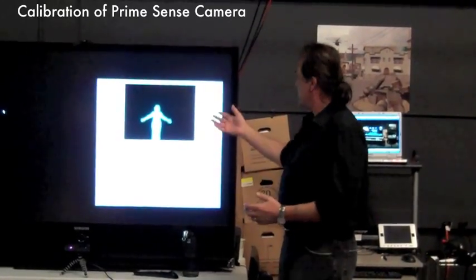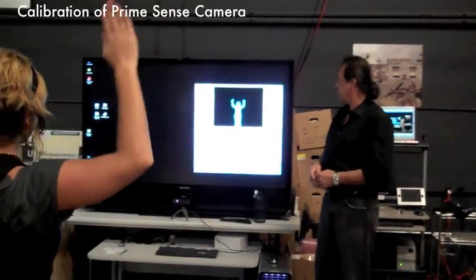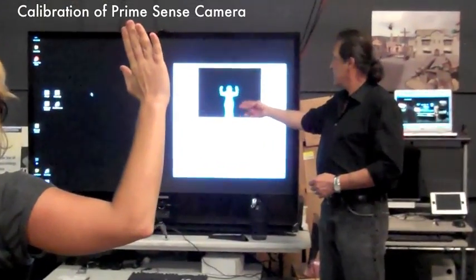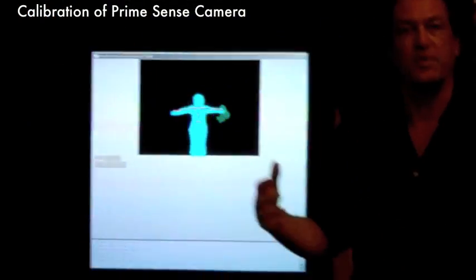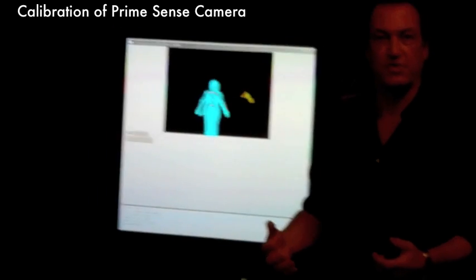You'll notice our user here is moving around on the screen. She's going to strike a calibration pose, and you'll notice a stick figure emerges from this. We can use this stick figure to actuate movement within a digital environment for the purpose of rehabilitation.